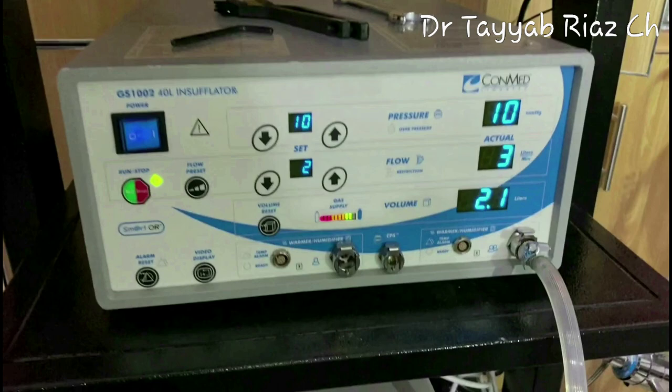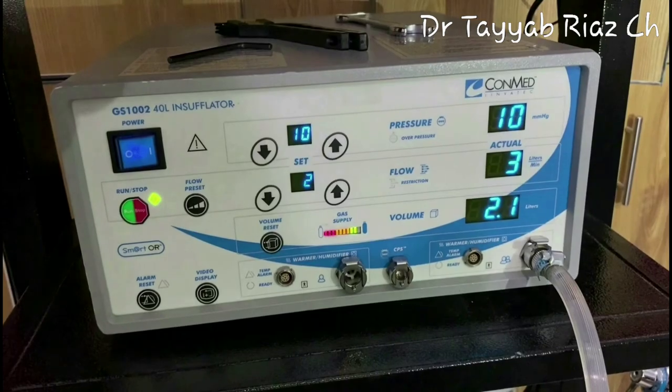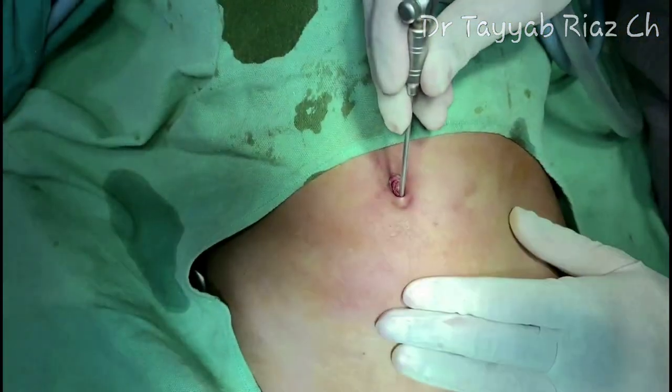If the patient is older, having a lax abdomen and is fatty, then you will need more gas to achieve your preset pressure. But in my scenario, the patient is thin built and young, I have achieved my preset pressure at a total of 2.1 liters of gas. And when you have achieved your preset pressure, you should remove the Veress needle and insert the cannula.